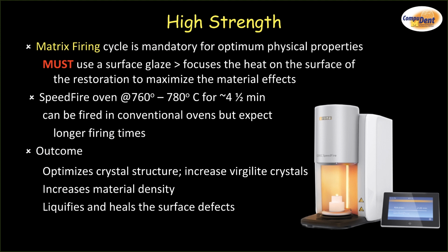Now, since you don't have to crystallize it, does that mean you just mill it and polish it? No. Because it's a hard material and it's milled, we have to ensure that it wasn't damaged during milling, and that's what matrix firing is all about. It's to optimize the physical properties that we get in the block form.